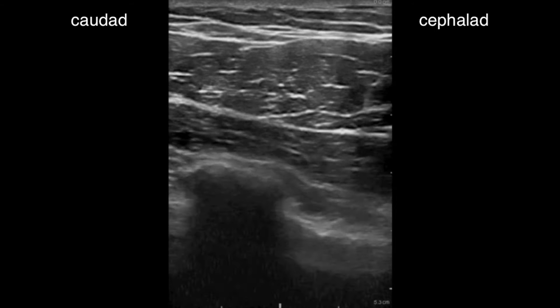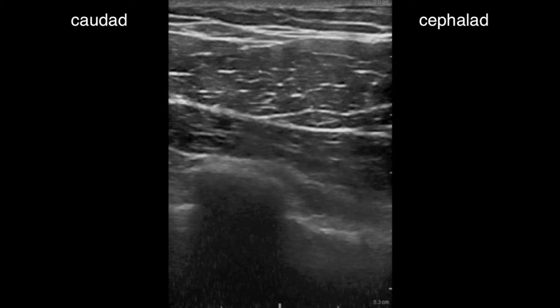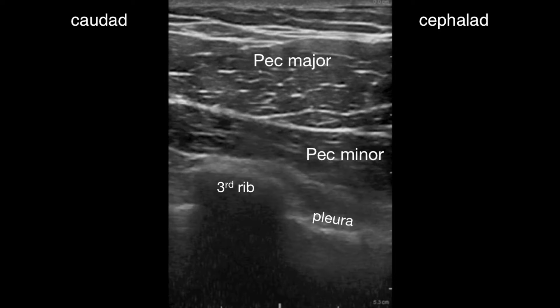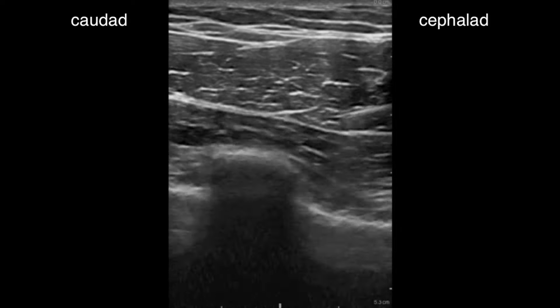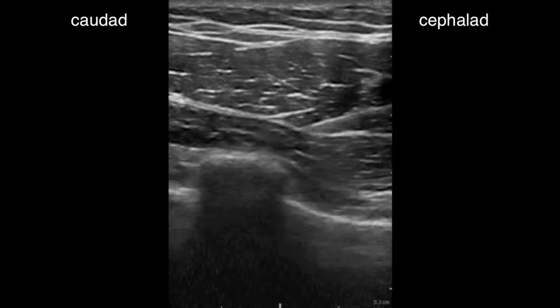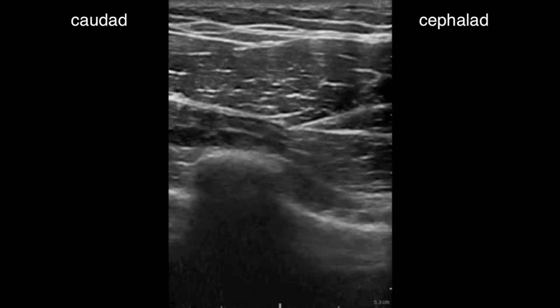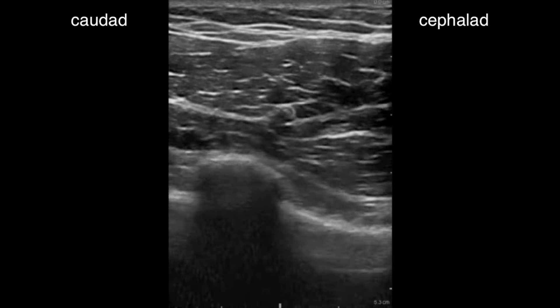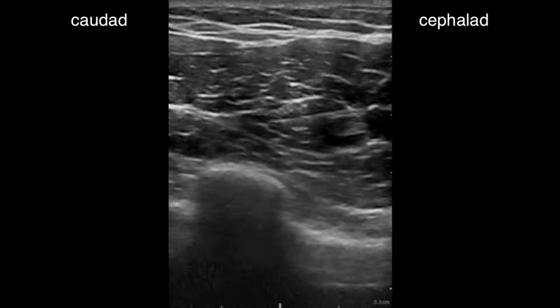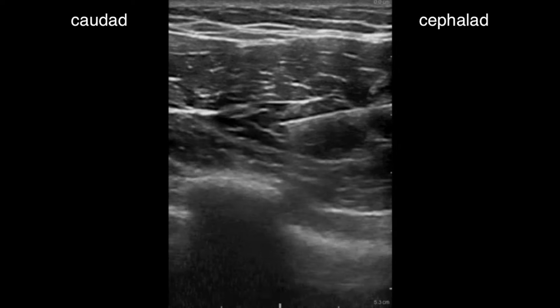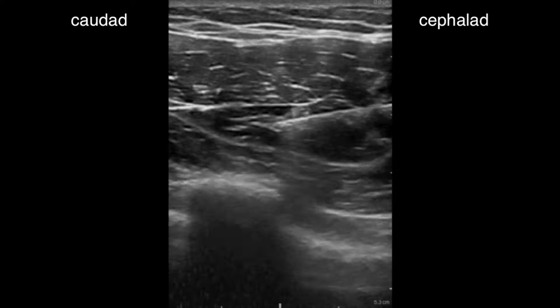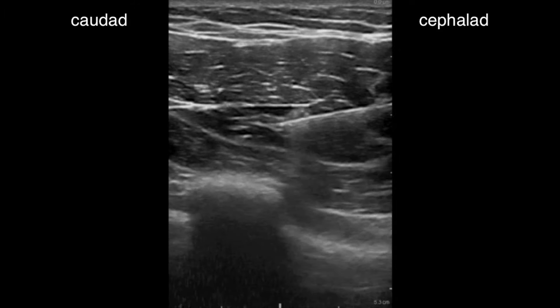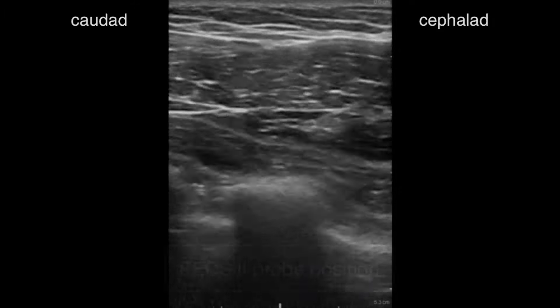Here's the pec major and minor and the third rib in real time. You can see pleura on either side of the rib. The needle enters from the cephalad aspect, passing through the pec major and entering the fascial plane between the two pec muscles. After negative aspiration, 10 mils of local anesthetic is administered. There's often a visible artery in this plane above the third rib — the pectoral branch of the thoracoacromial artery. It's a good landmark as it's close to the medial and lateral pectoral nerves, but take care not to injure it.